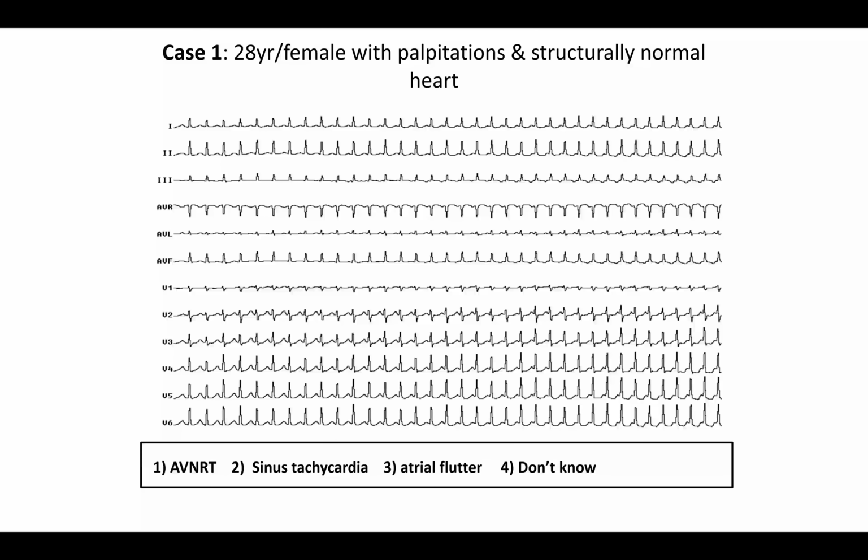But if it is narrow, we are more confused, because specifically if HV is long and baseline QRS is narrow, that means conduction through both the right and left bundle is equally slowed down, and that's why you have a narrow QRS. So baseline HV of 100 millisecond, although normal is 35 to 55, that means high-grade AV block chances are high.